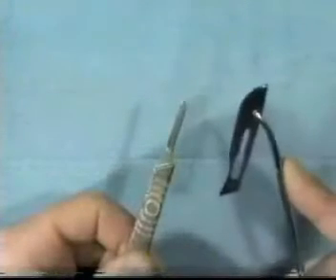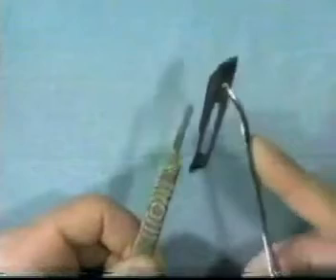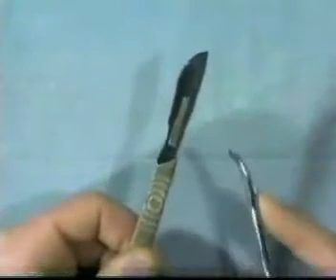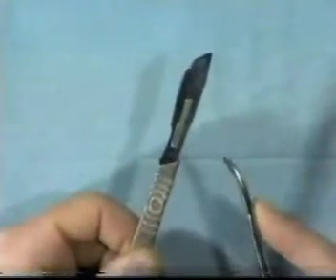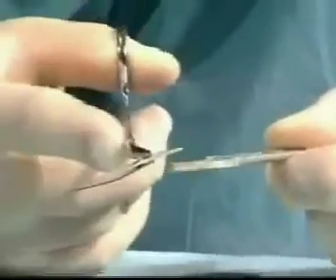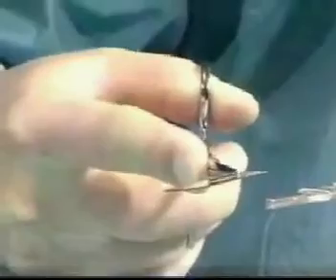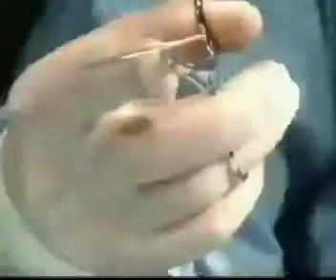Never handle a blade with your fingers — always use a hemostat. As seen here, slide the blade gently onto the handle. When removing it, lift it off from the distal end and slide it off gently without jerking. Immediately place it in the sharps bin provided.